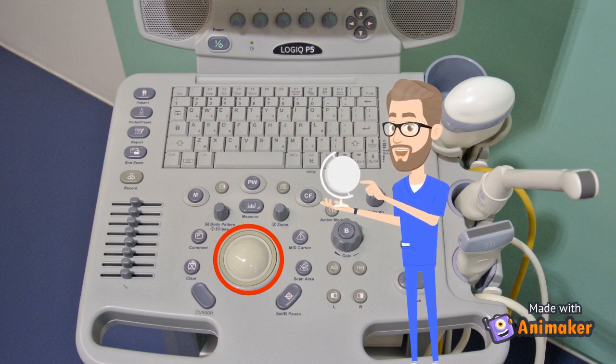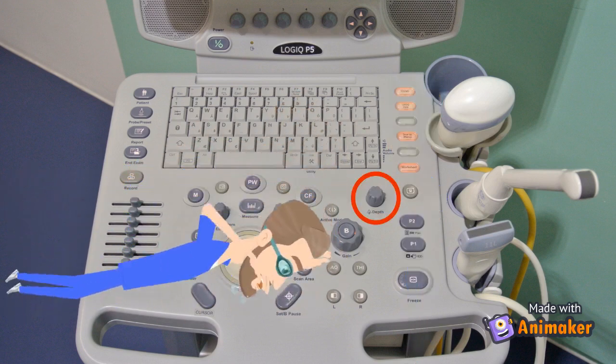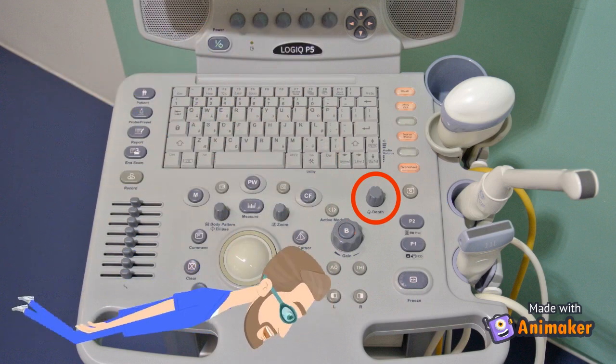This is the trackball. Most importantly, it is going to let you control the cursor on the screen. It serves other functions as well. For example, it can also change the size of your color box in Doppler imaging. This is the depth button. Rotating this will alter how deep or shallow your imaging appears on the screen.